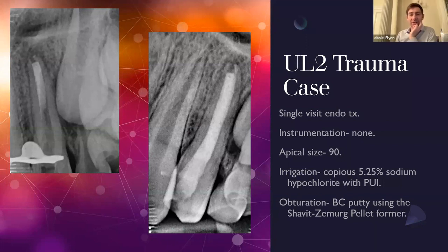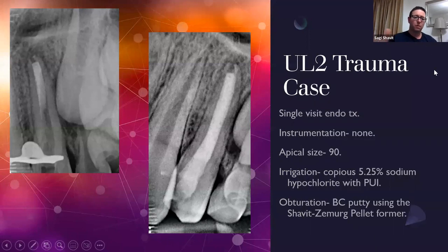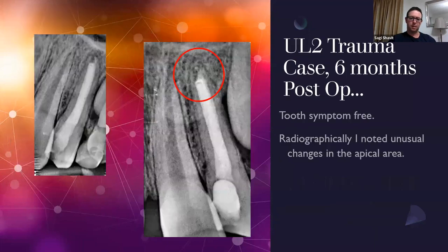Another question. Can these cases be done in one visit if it's dry or if there's no pus? Yeah, sure. I'm a true believer in single visits. So if the patient is symptom free, you can dry the canal, go for it. Okay, if you don't intend to do anything else with your calcium hydroxide, then go for it. But again, the patient already had a first visit with his dentist, so finished, I asked the patient, please come back in 6 months.